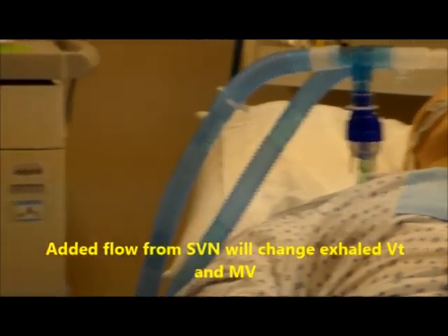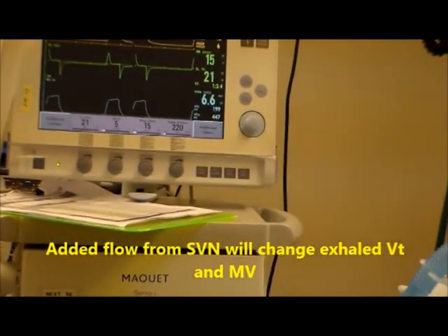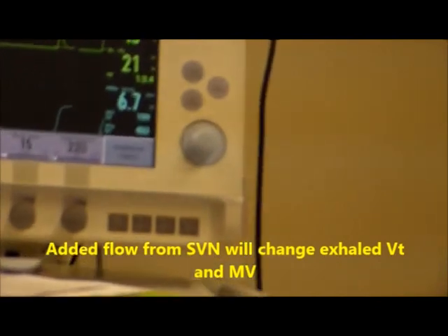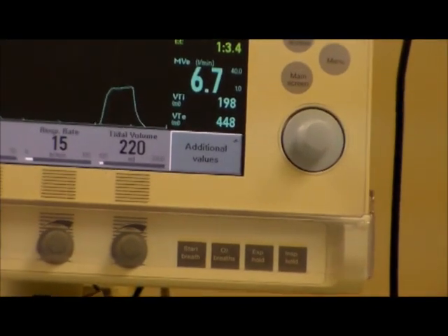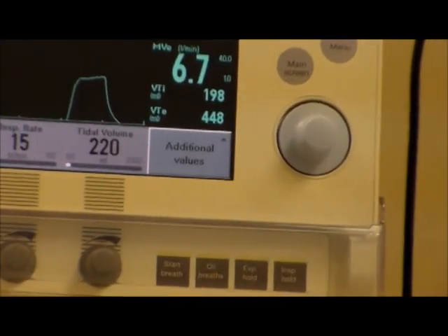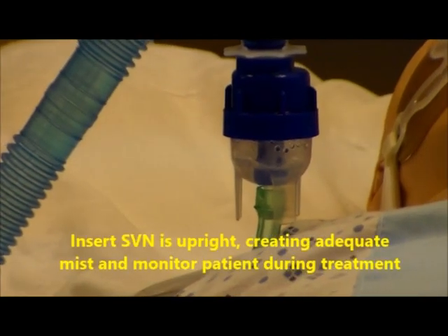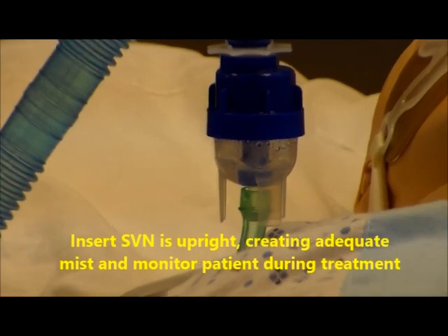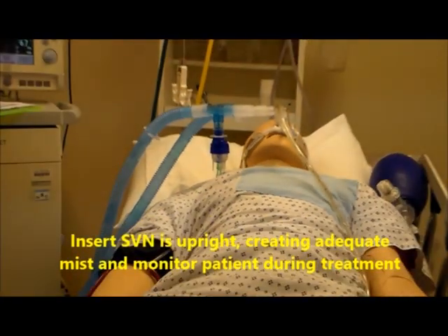With the nebulizer running, be aware that it will increase your expiratory tidal volume and alter your minute ventilation, as you can see on the screen. While the treatment is running, make sure you observe for adequate aerosol generation and monitor your patient throughout the entire treatment.